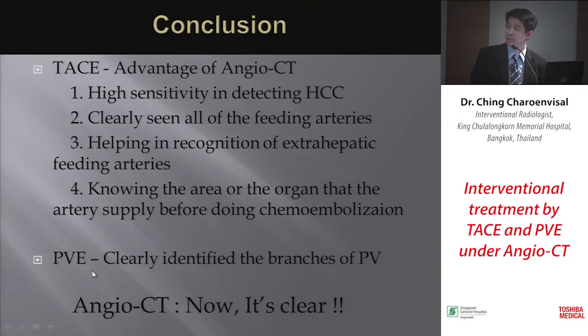And in PVE cases, we can clearly identify the branches of the portal vein, so we can do difficult cases of PVE. So the Angio CT is now clear.